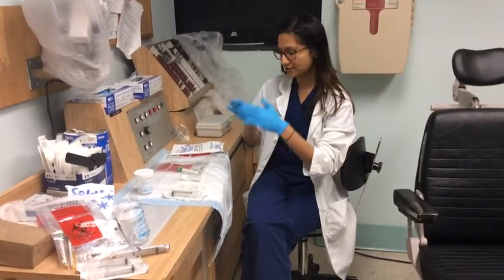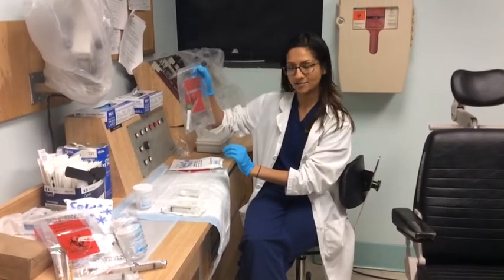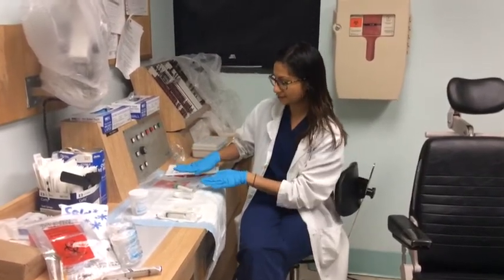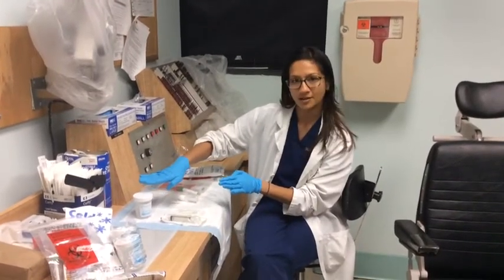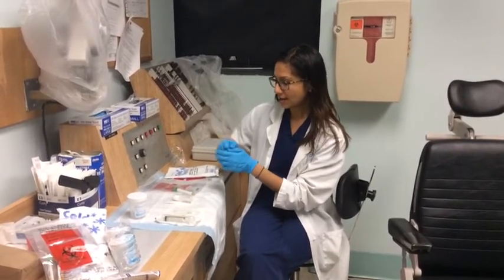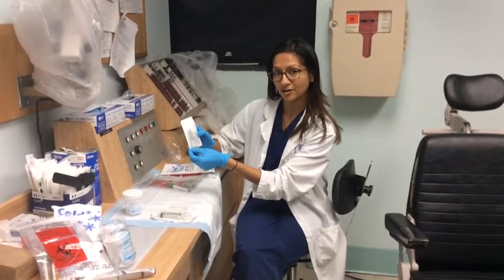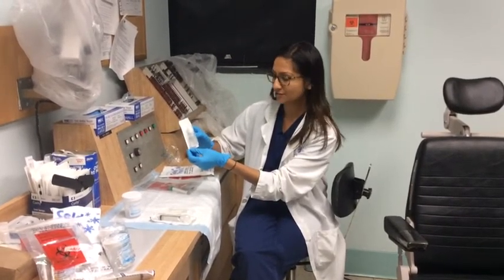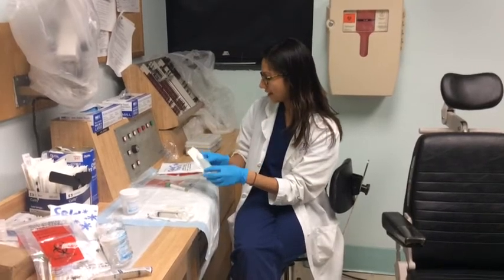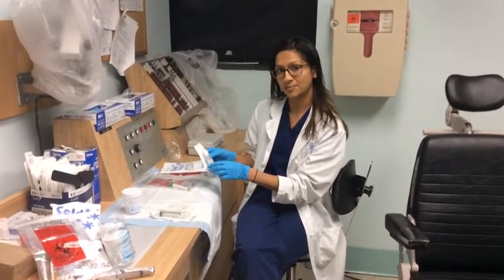We're back in our clinic now. We've set up to use the serum, which was already nicely separated from the blood by our lab tech, and make our diluted serum eye drops. We have a sterile specimen cup — no fluid, nothing in it. We're going to put the serum into the cup so we can then draw it up into a syringe. First, we're going to take 3 cc's out of our 15 ml BSS bottle and discard it, so we can add 4 cc's of serum to make a 25% solution. We're also ready with an ice pack and a Ziploc bag to send our patient home with the eye drops on ice.